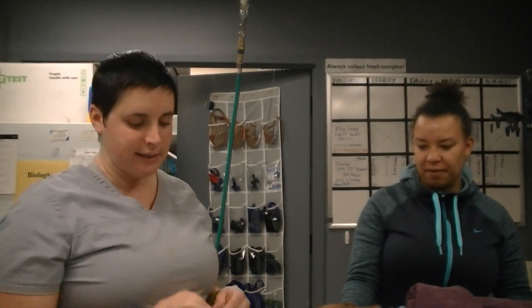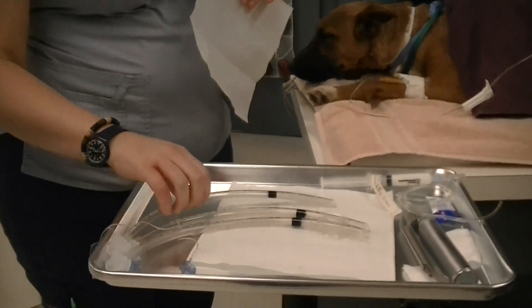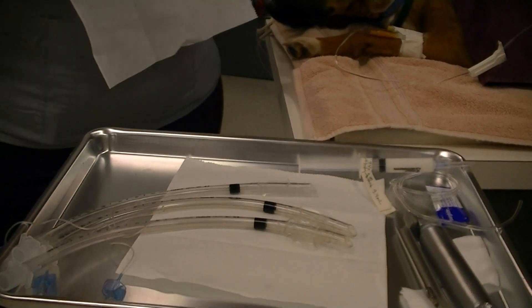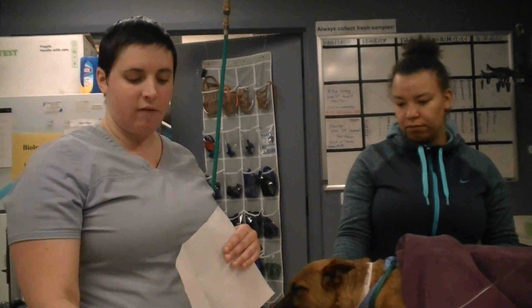We're going to talk about intubation supplies. I have picked three tubes that I believe are close in the size that we want for our patient. We don't expect you to pick out the exact right size initially, but we do want you to have three tubes at your station that you've eyeballed and think are going to be pretty close. I went with an eight, an eight and a half, and a seven and a half.